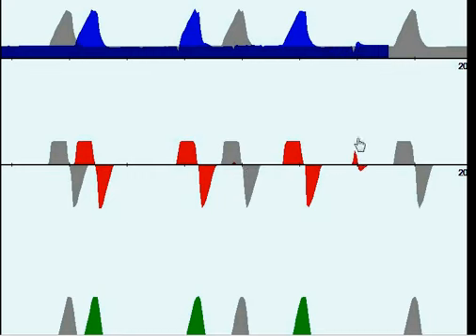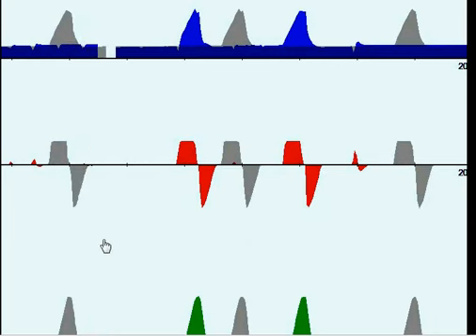And here's another spontaneous effort, and you notice that it's a spontaneous breath. However, it's for the patient's inspiratory phase and expiratory phase. It's not for a set inspiratory time or expiratory time. So this is an example of volume control IMV. And these breaths are unassisted breaths. So this would be an example of volume control IMV, and the patient is just breathing on top of PEEP or CPAP.